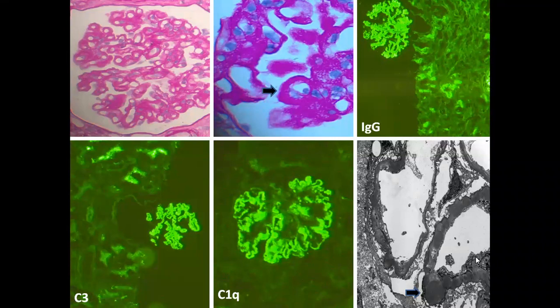On immunofluorescence, there was strong C1q. And on ultrastructural examination, you can see these deposits. Occasionally, this is also glomerular basement membrane only. It is not mesangial deposits. But not in all cases of class 5 lupus are you going to see mesangial deposits.